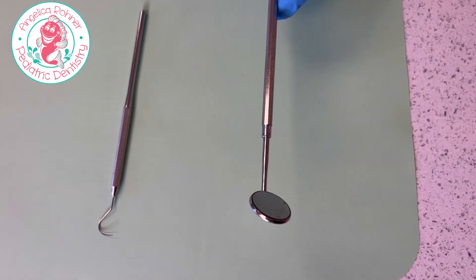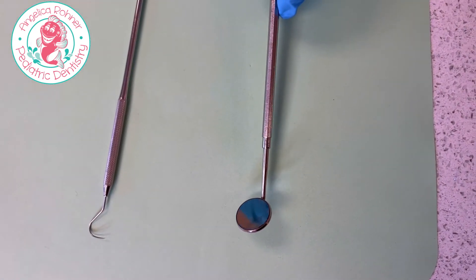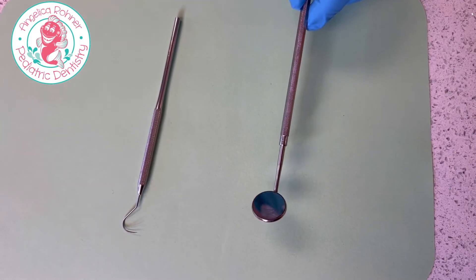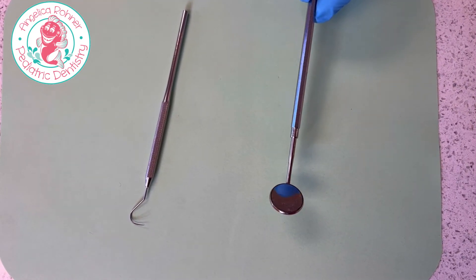This is called a Mira that we use in a dental exam. We use the Mira to look at all surfaces of the teeth and all the soft tissues in your mouth.